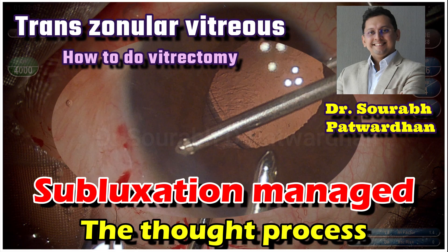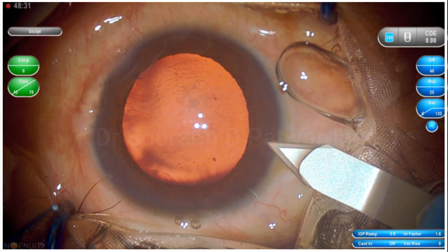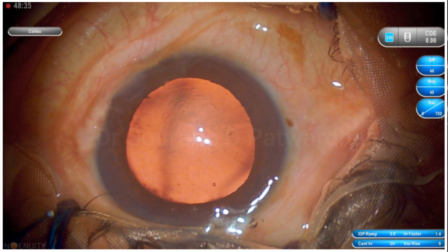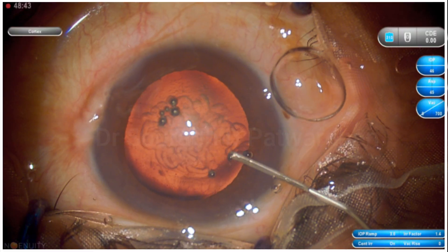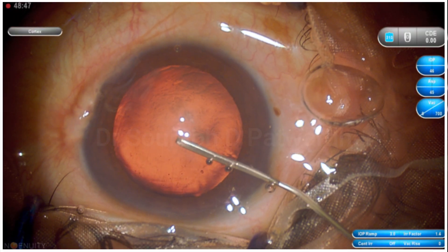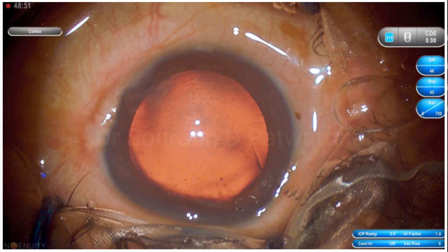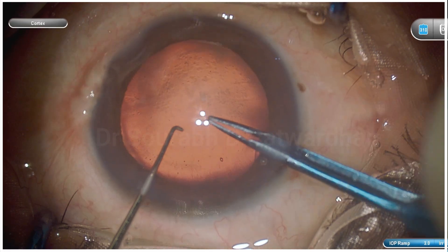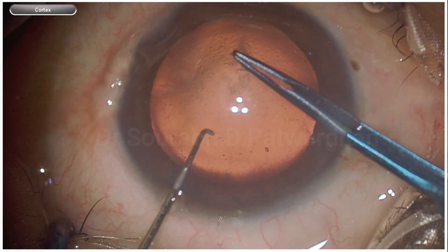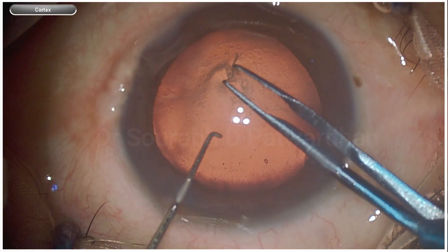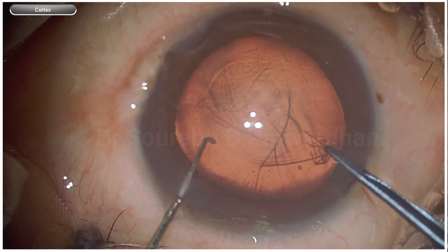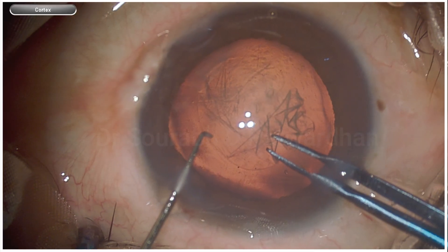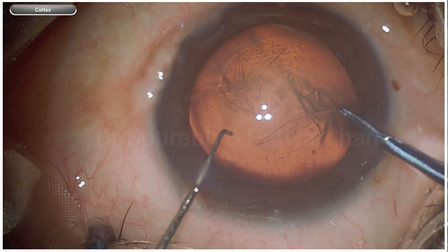It's not a very uncommon situation where we find that there is a subluxation in a patient on the table. Many times these patients do not give proper history preoperatively. When I made the incision and started injecting viscoelastic, you can see the edge of this crystalline lens, and usually that means there is some amount of subluxation. The zonules are broken somewhere. We can know the extent of the subluxation when you start doing the rhexis. I am doing capsulorhexis using forceps here. Wherever the zonules are giving good counter traction, you will not see much of the folds, but the moment you enter the area where zonules are weak, you can start seeing these folds.